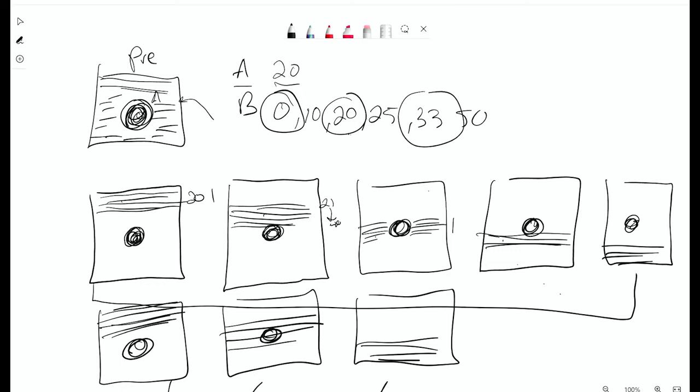But the trade-off here is this takes longer. Like maybe this temporal resolution was 6 seconds. This temporal resolution is 8, because it just takes longer to fill more lines of K-space. So same thing. As your temporal resolution worsens, right? As it gets longer between phases, your temporal footprint lessens. Does that make sense? Yeah, so 50% would be just twice. They got two tries to screw it up.